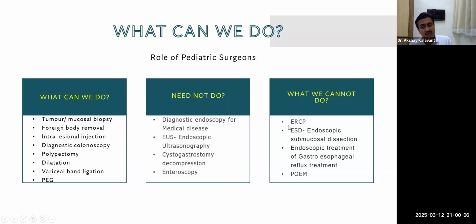So again, spending time on learning this, and it requires a high skill to get this procedure done. So I don't think that we need to really work so much on this, because ultimately we will not get many patients, and we are not really going to treat these patients. And for that matter, even pediatric gastroenterologists in most places are not exposed to ERCP. They of course take the help of adult gastroenterologists to do these procedures.